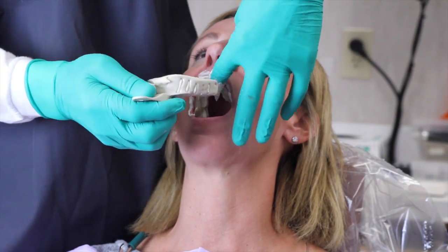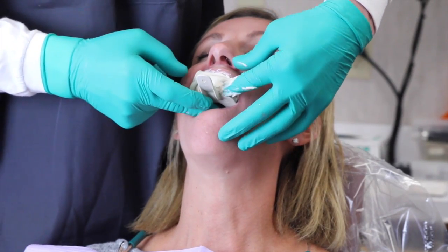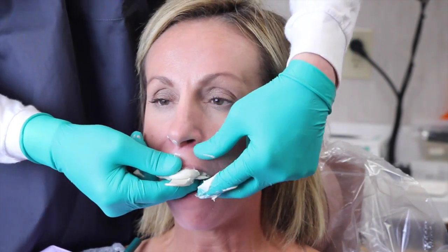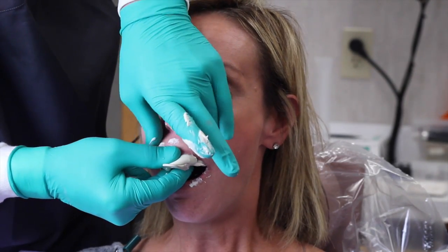Donna then hands to me the high viscosity material. And then insert that. And Debbie, if you could please wrap your upper lip around that tray. Great. If you have the patient help you a little bit. Now, if you could lean your head forward a little bit. Wonderful. Now, right now what I'm doing is border molding. Are you doing okay there? You doing all right? Pardon me for making a little mess here.